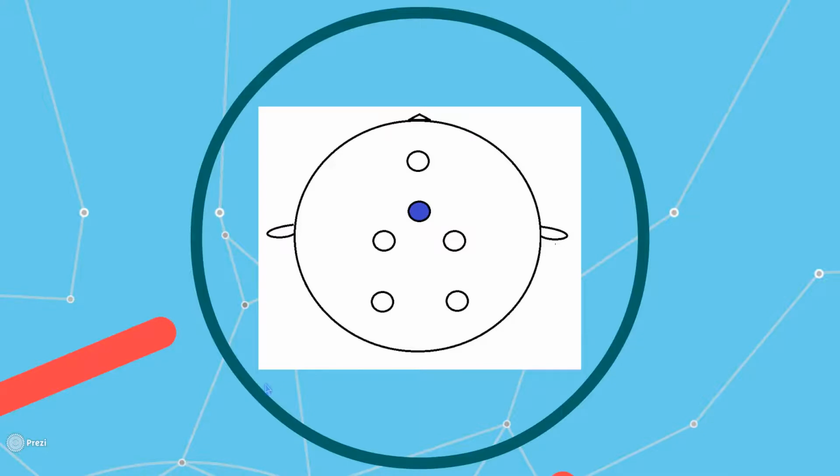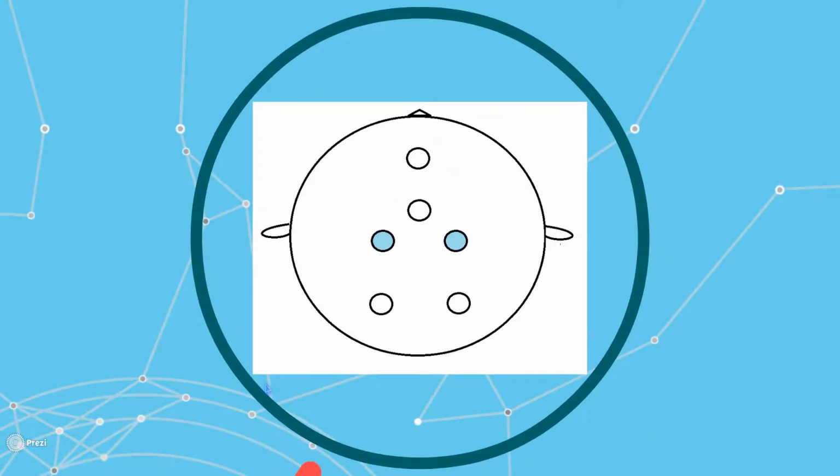This EEG montage will have one electrode in the center of the scalp where noise is the smallest for the reference electrode. Two more electrodes will be placed around the center of the scalp by the motor cortex where the mu waves are the strongest. Studies at UCSD have shown that these two electrodes should be efficient enough for our purposes.